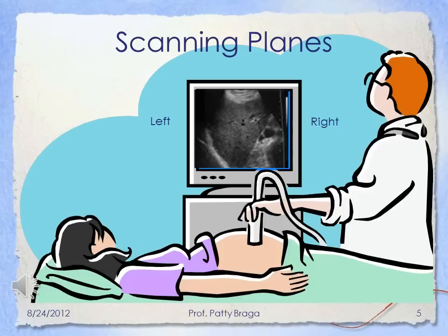in that position, the top of that screen that you're looking at right now is anterior. That's where the foot of the transducer is, so that's anterior. Bottom of the screen is posterior. The left side of the screen is superior, meaning towards the patient's head, and the right side of the screen is inferior, towards the patient's feet. And that is very important for you to know.